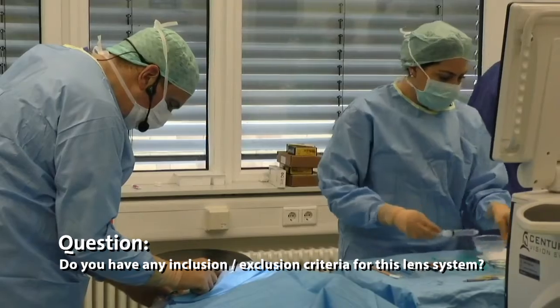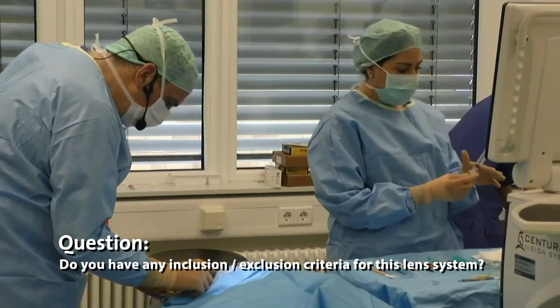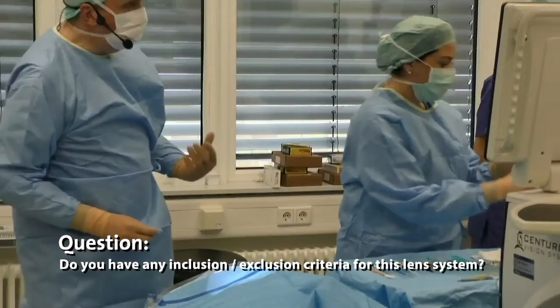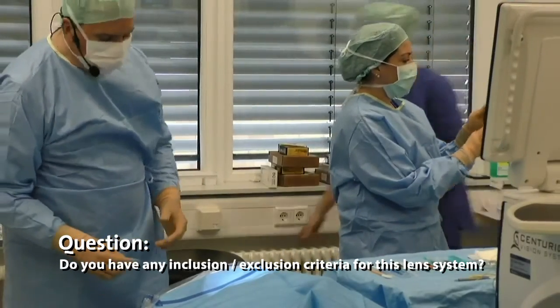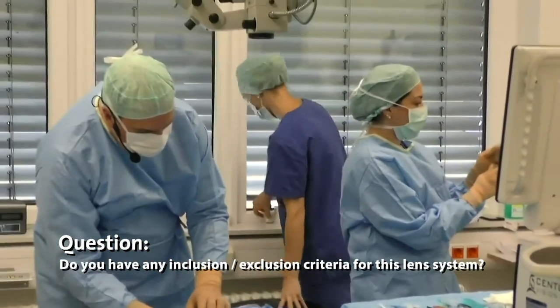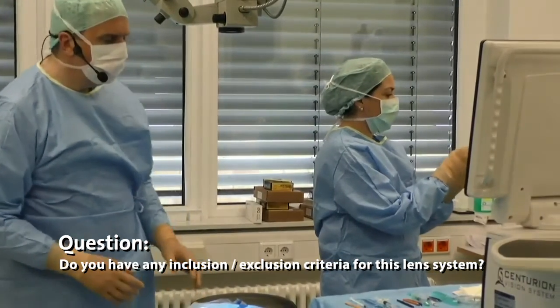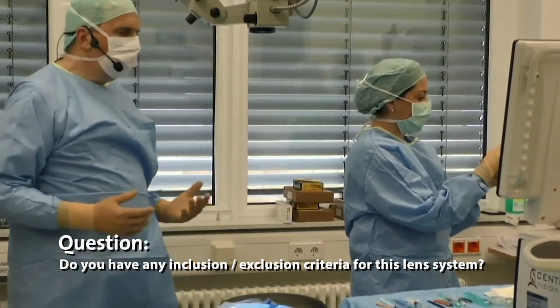If you have a stable intraocular lens, let's say 10 years after cataract surgery, there's no need to be afraid of an additional implantation. Do you have any other inclusion/exclusion criteria for this lens system? Only the depth of the anterior chamber, maybe some other pathologies inside the eye. I cannot remember one where this was the case, but no.